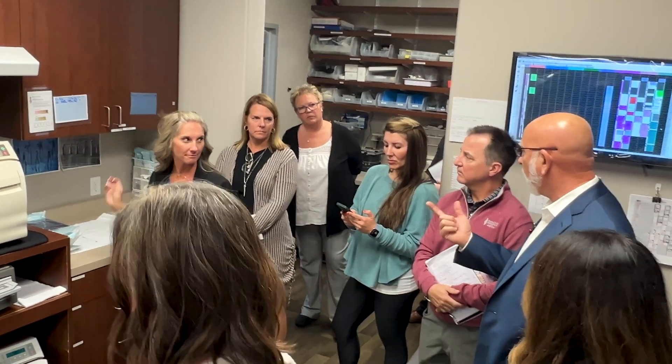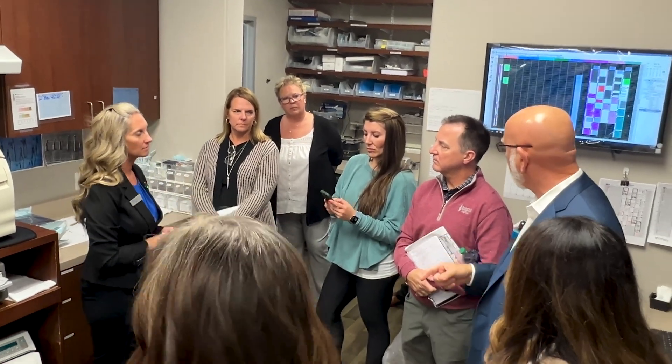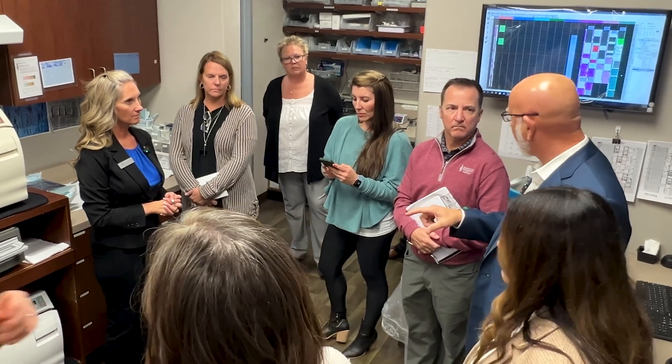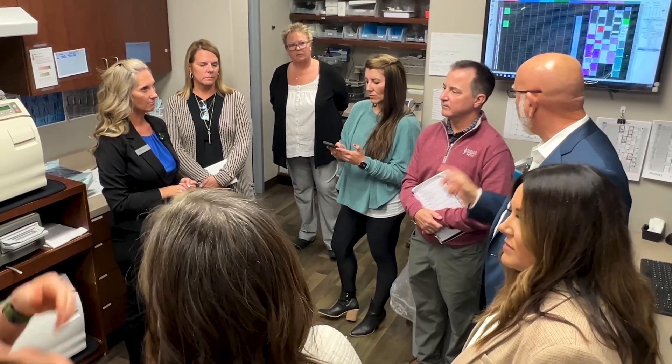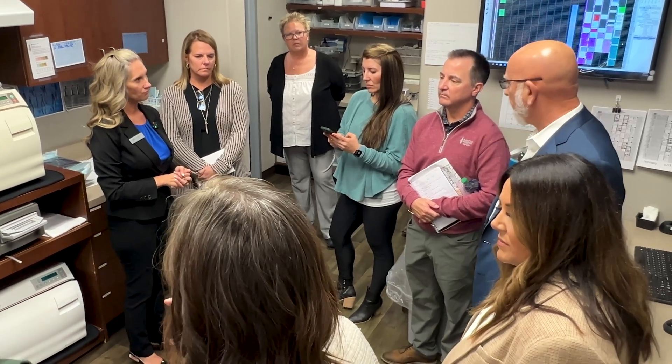The exam kit will be a pedo hygiene kit too, so pedo hygiene is going to be the basic kit. You've got a hygiene kit, an operative kit, an endo kit, a surgery kit — but hardly any of those last two. Of course, there's an implant one too.